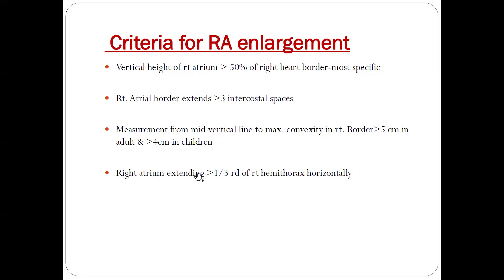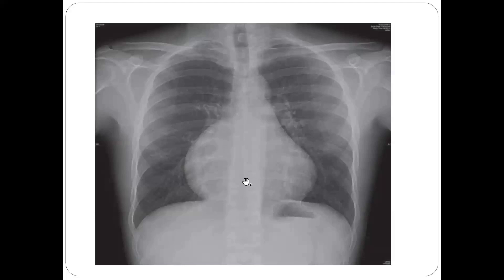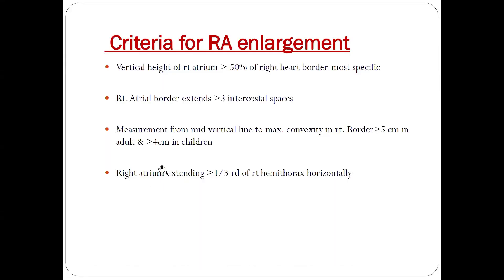Fourth criterion: if the right atrium is extending more than one-third of the right hemithorax. You measure the distance from the spine to the right atrium, and from the spine to the hemithorax. If the right atrium distance is more than one-third of the hemithorax distance, it is also called right atrial enlargement.